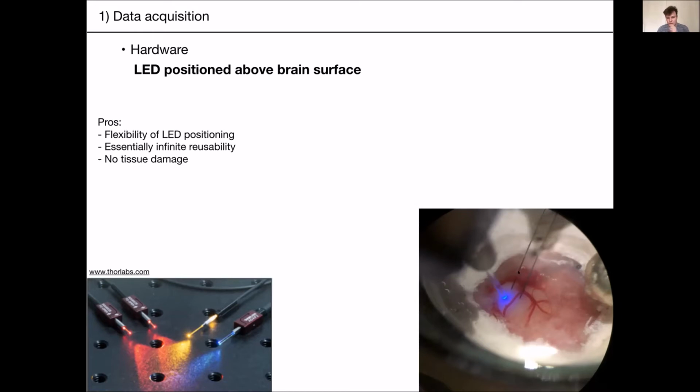This is a craniotomy. Hang on, this is something, there's probably a Neuropixels 2 probe, right? No, it's a Neuropixels 1. It's 2 Neuropixels 1 probes stuck to each other. Okay, good. So this is something that people can do if they buy. Okay, good. Yes. Sorry.